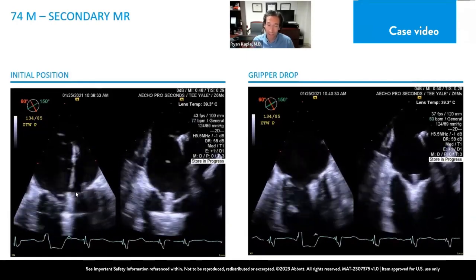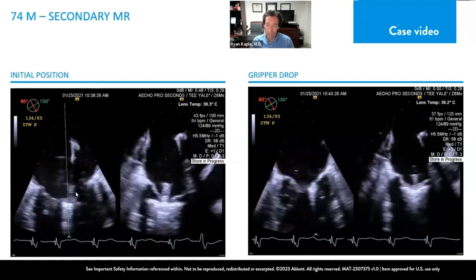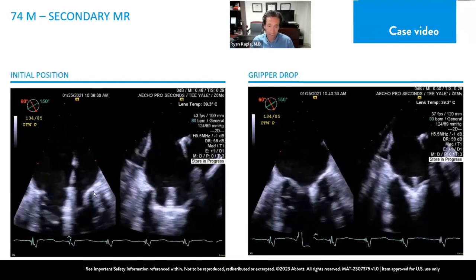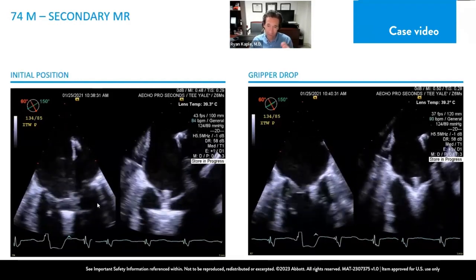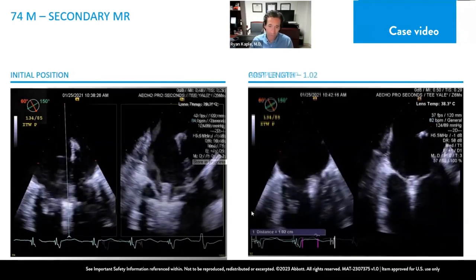And just a reminder that anytime you make adjustments like that, especially with the M knob, take your time, go back to 3D and check how your arms are aligned relative to the line of coaptation, because you may have to clock or counterclock an hour or so to get yourself into position.